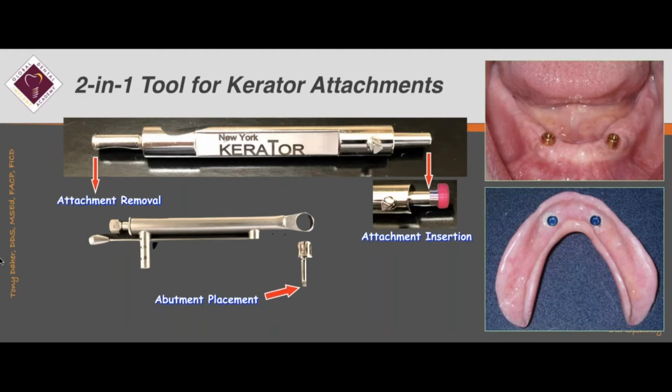And also you have to buy that special driver. It fits inside this tripod tri-lobe feature. And certainly you have to have a torque driver to be able to get it into place with 20 Newton centimeter.